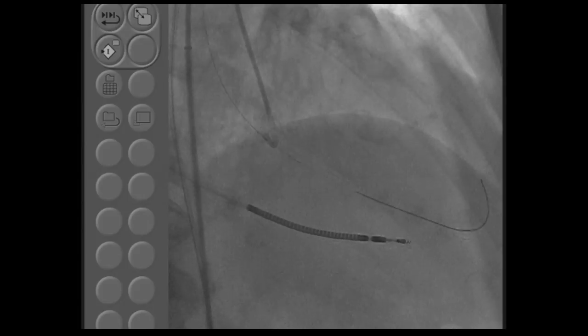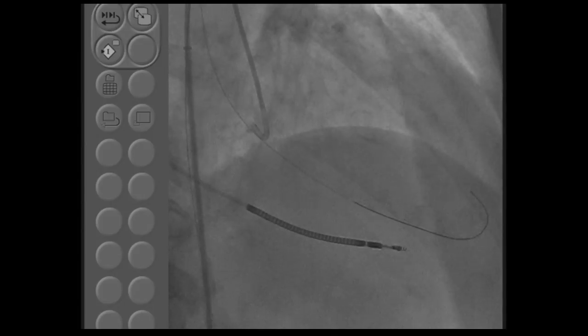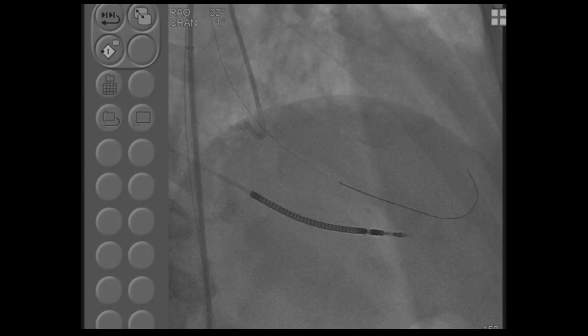Also important, as soon as you have your sheath inserted, you have to have your anticoagulation going, whether you decide on heparin or Angiomax. We actually have Angiomax, and our ACT is about 320. As long as your ACT is about 270 on heparin with the long sheath in, because you cannot have this 14 French sheath without any anticoagulation, because you can have clots formed within the sheath.